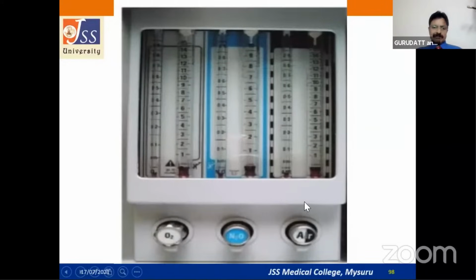One more thing here: you can see just above these flow control knobs, there is a slightly projected part of the flow meter assembly. This is called a guard. So inadvertently you cannot move these flow control knobs. This is another safety feature you should always remember. Sometimes they may suddenly ask you why it is projected like that. It is a guard for the flow control knobs.